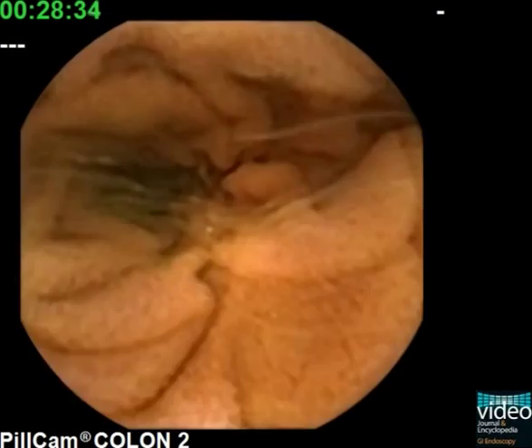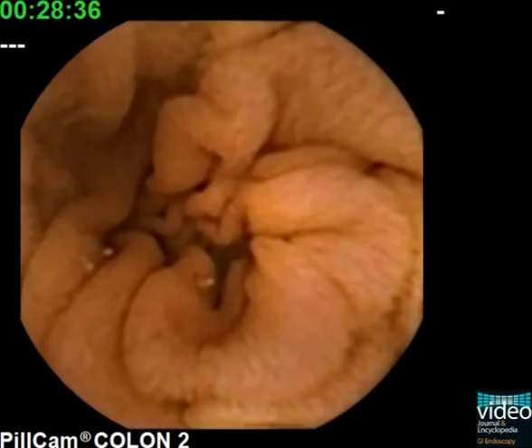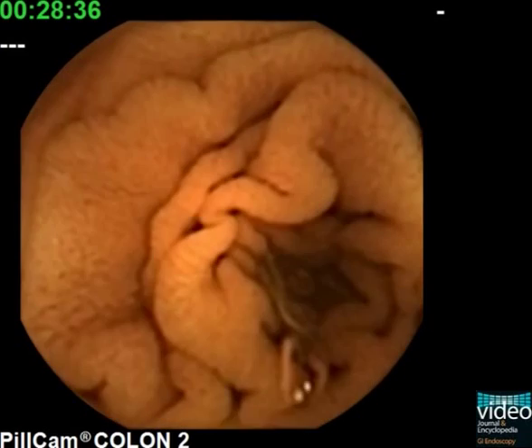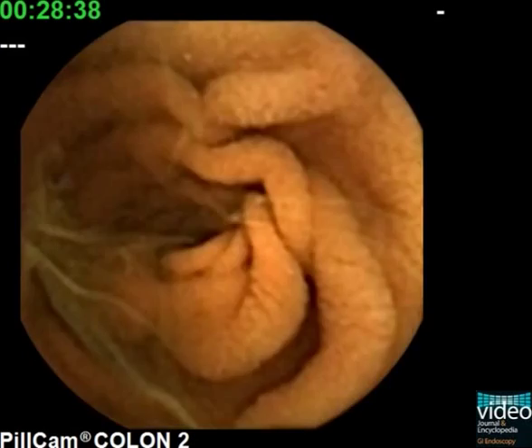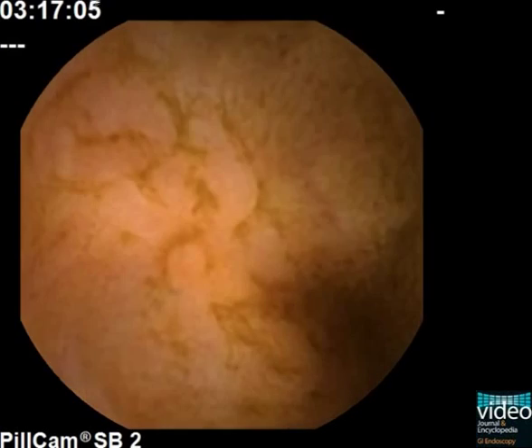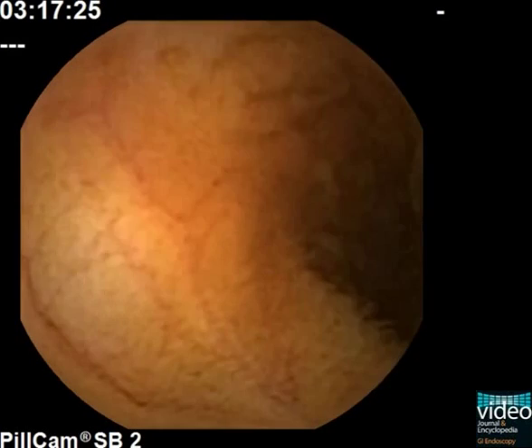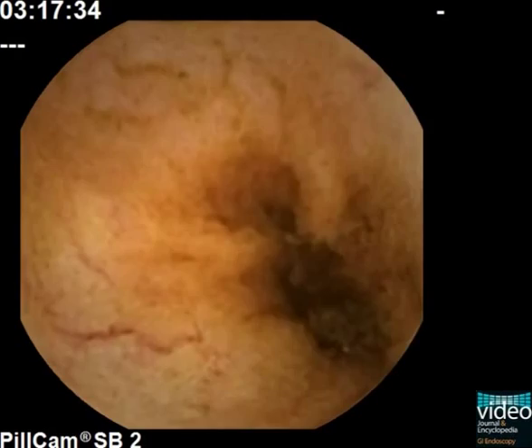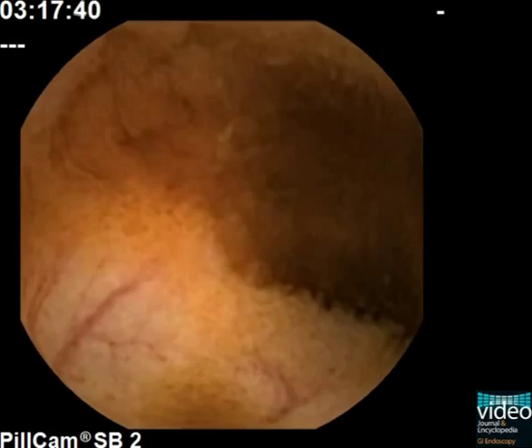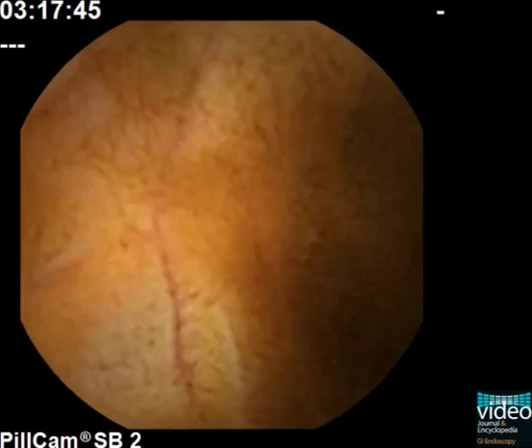The normal small bowel mucosa has an intact villus architecture that is well demarcated at capsule endoscopy. With progression of the capsule to the mid and lower third of the small bowel, the villi become shorter and mucosal or submucosal blood vessels may physiologically be seen.